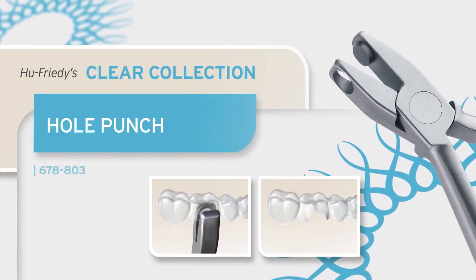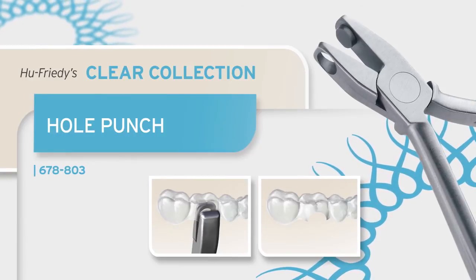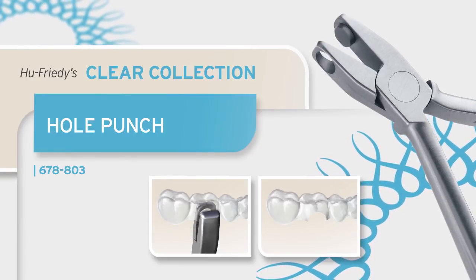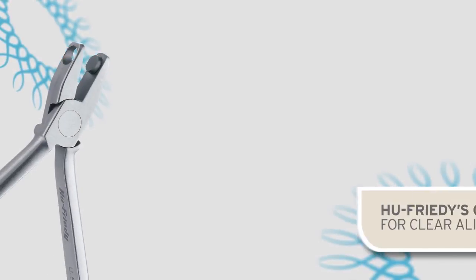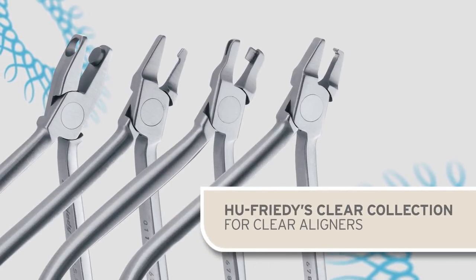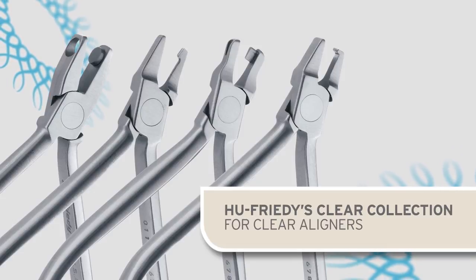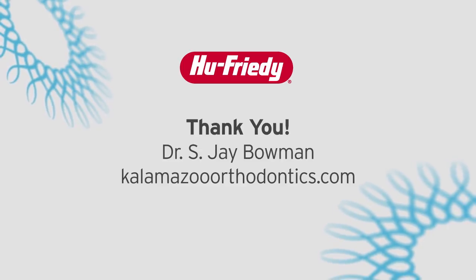The hole punch can be used to enhance individualized clear aligner treatment, thereby increasing the versatility and applications of many types of correction. Or it may simply be used to relieve the discomfort resulting from tissue impingement from aligners or clear retainers. The Hu-Friedy Clear Collection of instruments was specifically designed to accent, individualize, and enhance the biomechanics of the invisible aligner experience. The right tools can certainly make a big difference.